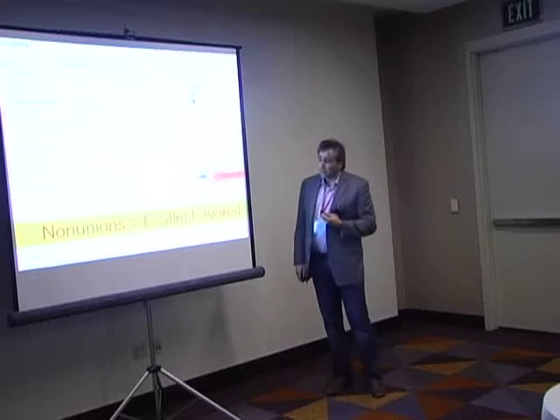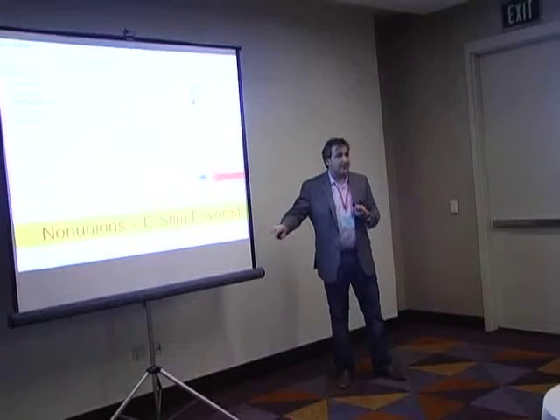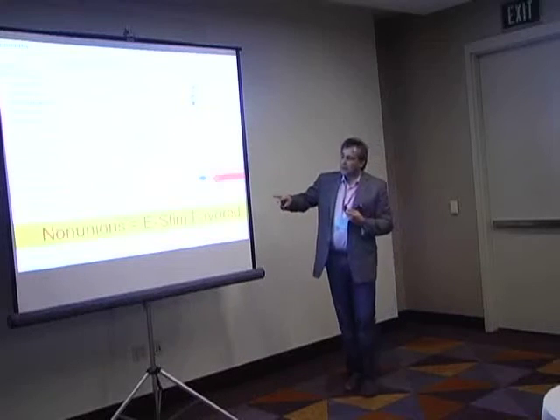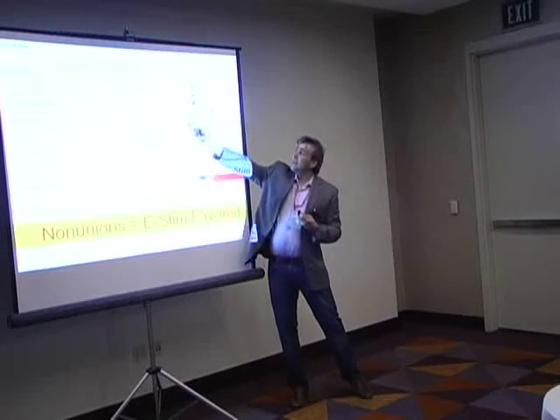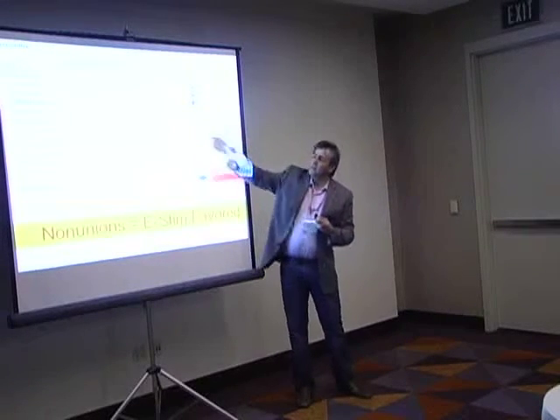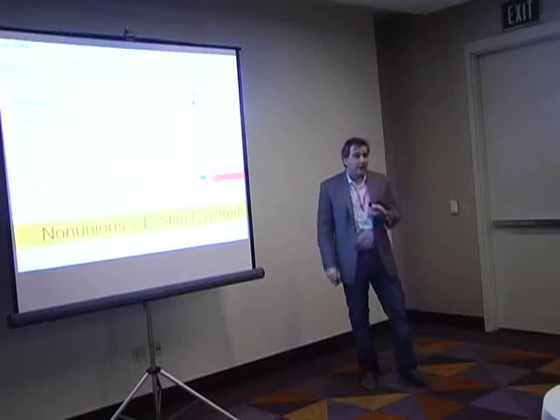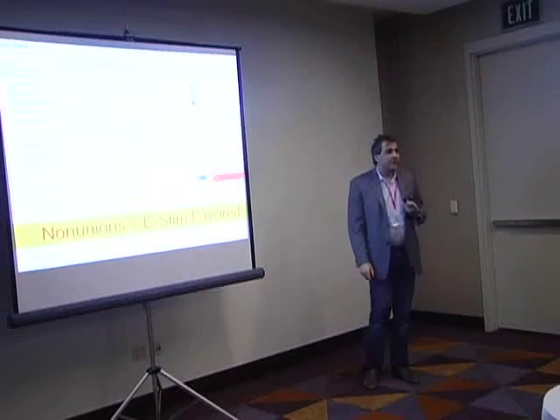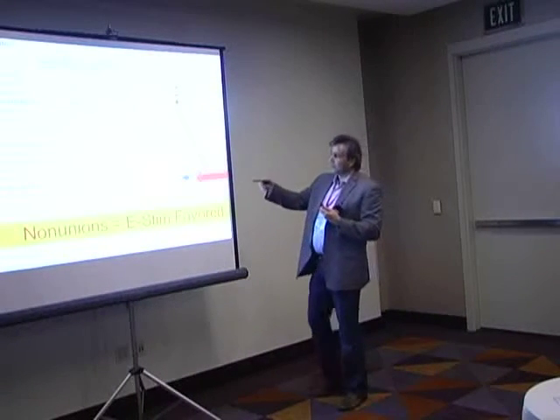So when we do a network meta-analysis, this is again, albeit very early, published data, so I can speak to this. When you look at this, you see that for fresh fracture healing, this side favors ultrasound, this side favors eStim. You can see that there's a trend, even though it's not significant. It suggests that ultrasound may have a slightly stronger effect over eStim in fresh fracture healing, largely because there's probably just limited data on both sides.